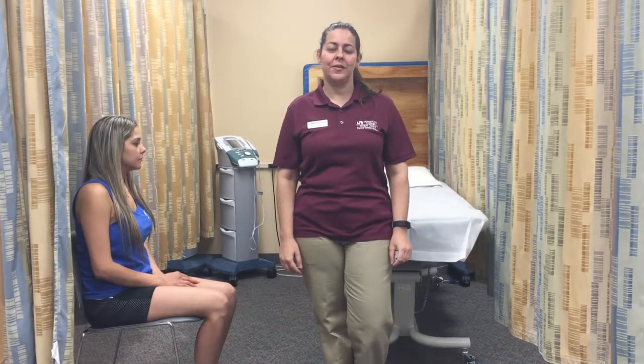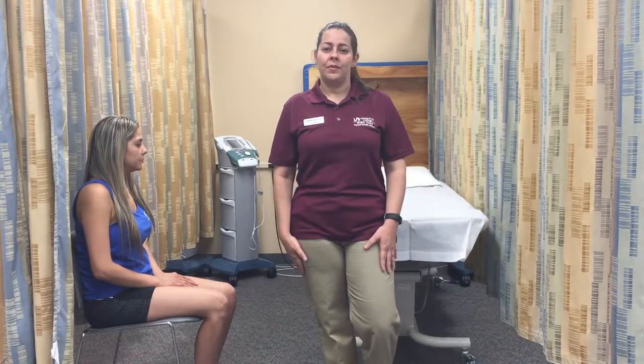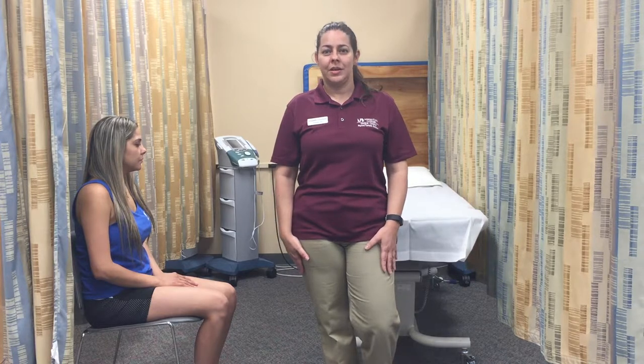Hello, my name is Johanna Velazquez. I'm a physical therapist assistant student here at Miami Dade College. Today I'm going to be performing a measurement of the range of motion of the abduction of the shoulder. According to the AAOS, the normal range of motion of the abduction is 180 degrees.